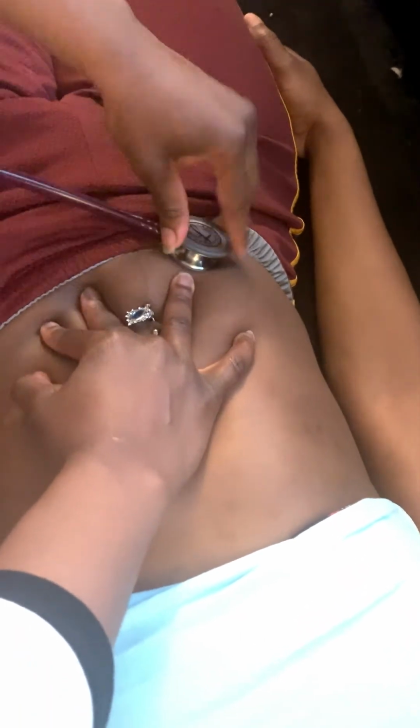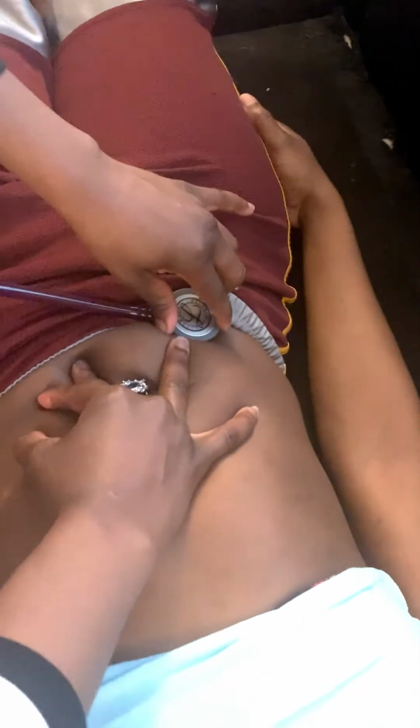All right, and I will do an upside down V to listen to the iliac artery. So the iliac. And the iliac.